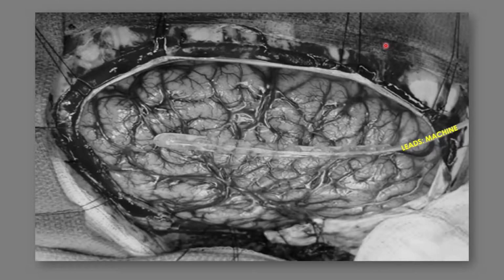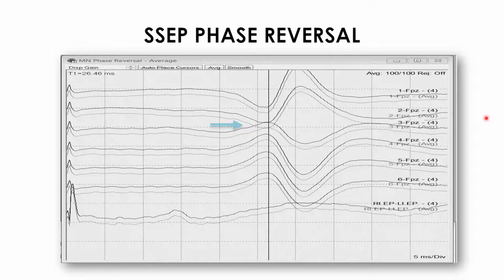During cases where a tumor might distort the anatomy of the patient, and the surgeon needs our help identifying what's motor and what's sensory, an electrode might be placed directly on the brain. This particular electrode has 6 contacts, and we plug it into our machine on our end. We do a median nerve SSEP using each contact and referencing it. We're using a referential montage, and we look for an N20.